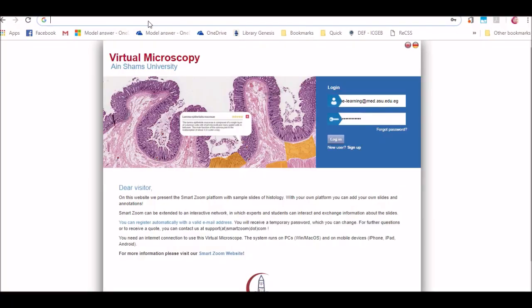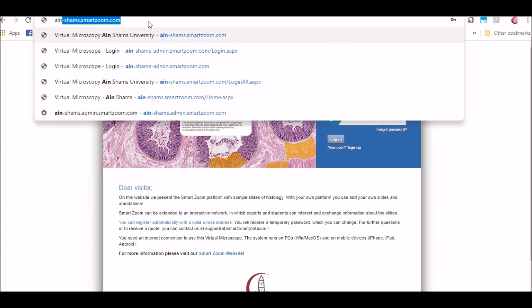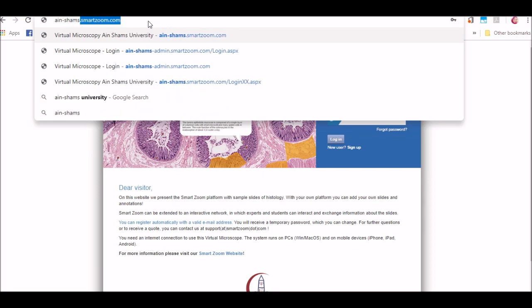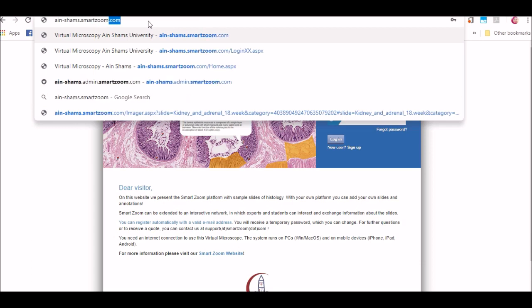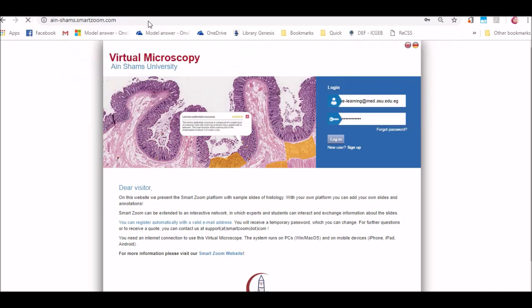First step, type in the search bar of your browser AIN-SHAMS.SMARTZOOM.COM. Then click on sign up.